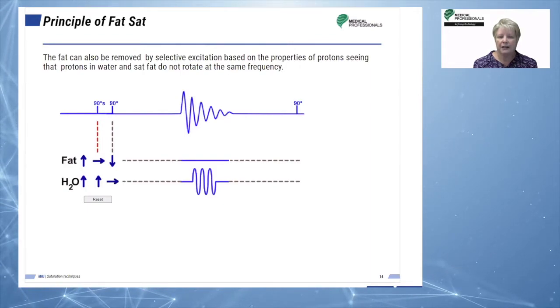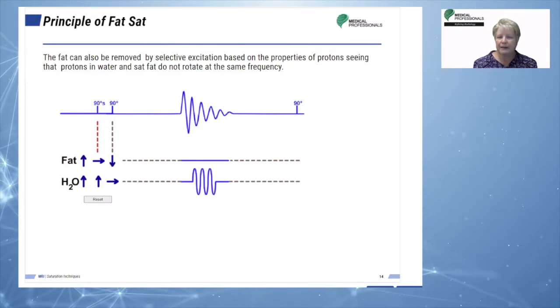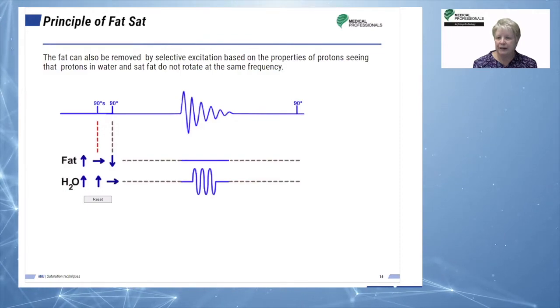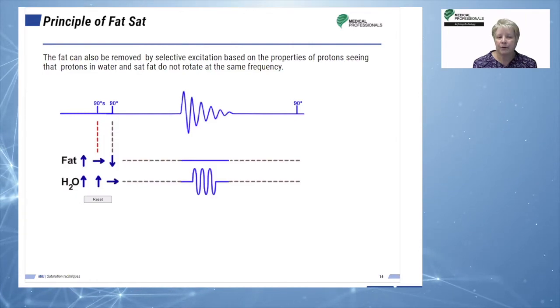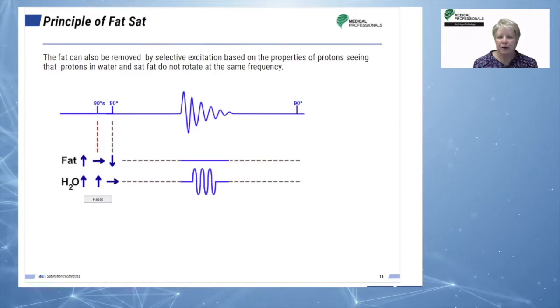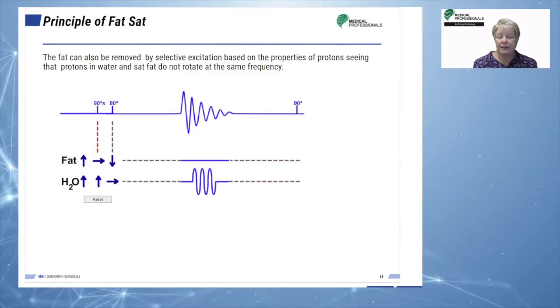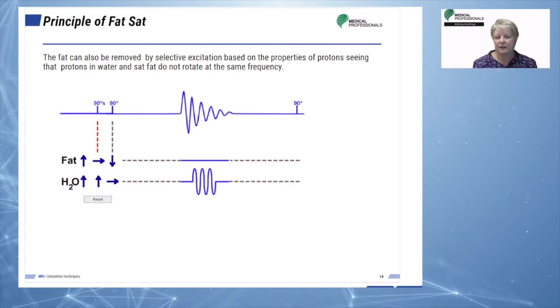This involves a 90-degree flip, or a fat sat for Siemens, a 60-degree flip, classic fat sat, or 90-degree fat sat for GE, and a 100 to 110 flip, or SPAIR, SPIR, for Philips. But the underlying principle is always the same, regardless of the degree of flip. There are other methods to cancel the fat signal that involve the selective excitation of water. These techniques are dealt with in a more advanced course.